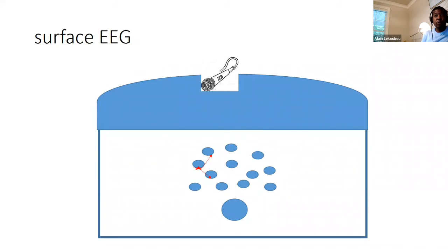Okay, then you can go and do surgery on that, provided the patient will not have any sequela from that. And there's a way to mitigate that risk. Okay. So surface EEG helps sometimes, but not all the time. That's why you need the stereo EEG to be able to exactly localize where things are coming from.